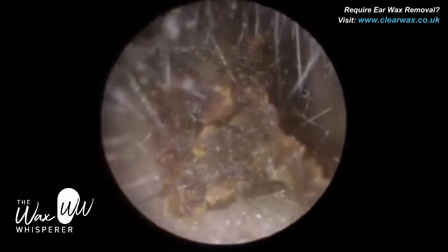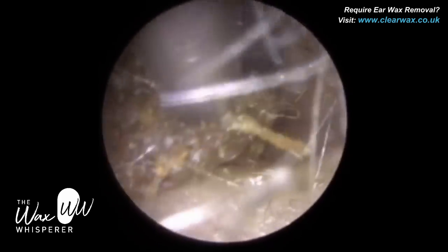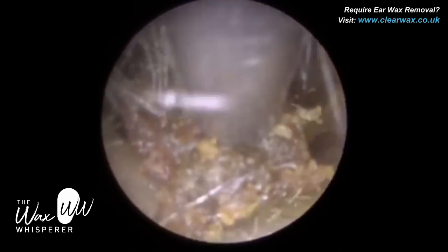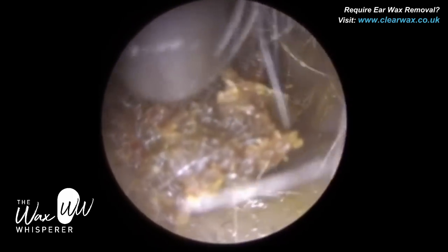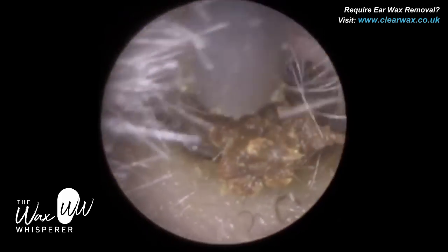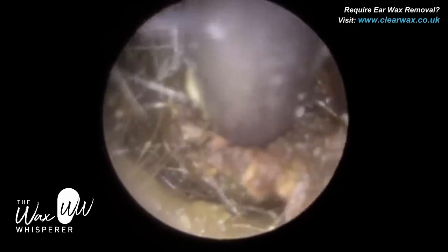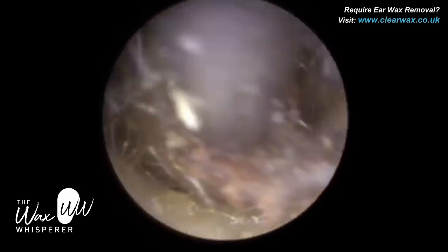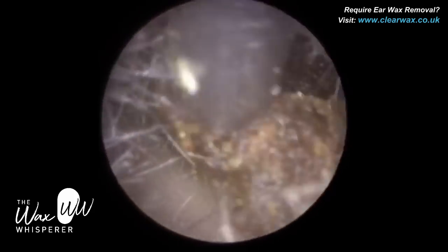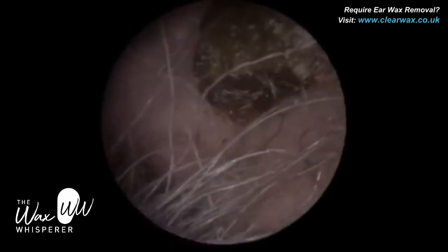That is also bringing the rest of the plug of wax out. Just a segment of wax that tore off — back in with the Zolnir suction probe. This procedure with the suction tip is called microsuction. You can see I'm just gently tugging this wax, lifting it up and down. The tube got blocked. I was considering putting in some olive oil drops just to lubricate the plug of wax and stop it from sticking to the suction probe, but eventually it just came out in one single big mass.